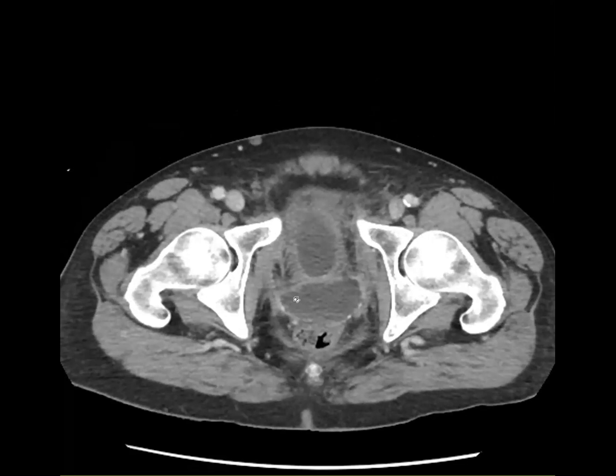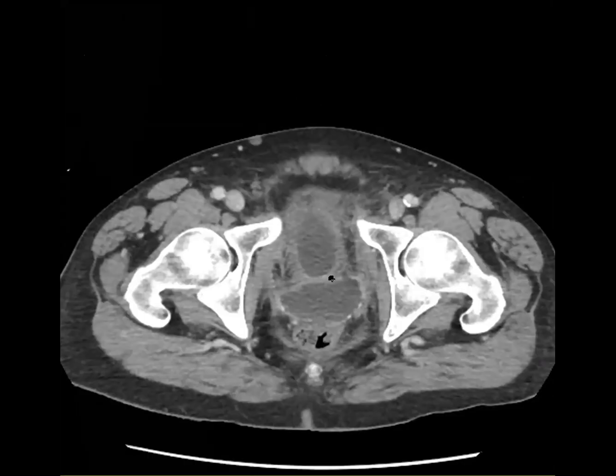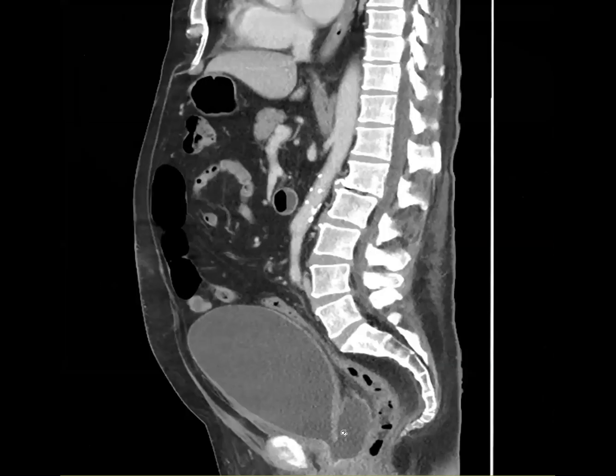So this is one of the not common but important complications of robotic assisted laparoscopic prostatectomy. It could be intraperitoneal or extraperitoneal. Here in our case, it is mainly extraperitoneal. Since this is pretty huge, we can evaluate it on regular CT, but if it is very small, then we might need a CT cystogram. I think they usually manage it conservatively, but if not, then they will again have to do some kind of repair.